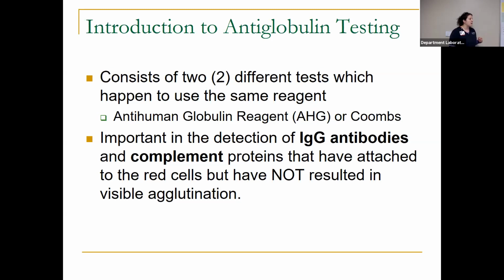And if you think about that, in hematology, we talked about hereditary spherocytosis, and we also talked about autoimmune hemolytic anemia, where the antibody could attach to the red cells, and the spleen is either going to try to pit it, where it's going to try to pinch off that foreign antibody, or it's going to completely destroy the cell. And if that's going on inside the patient's body, we want to know what's coating patient cells. So in a DAT, the anti-human globulin test will let us know, is it due to an IgG antibody or is it due to complement?